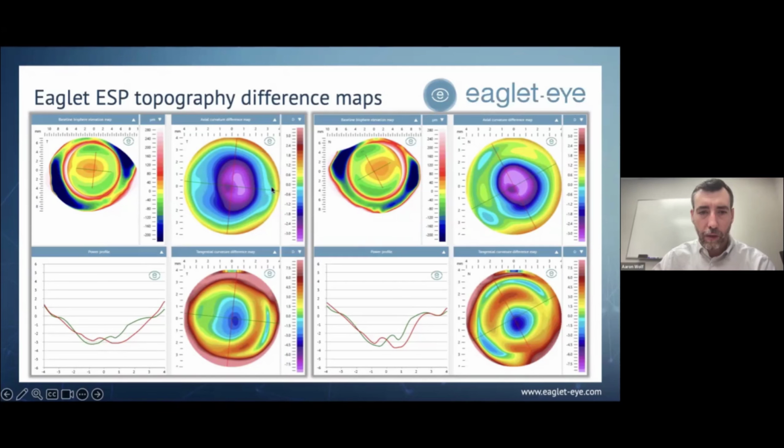Where's my green start? Well, my green's a little bit further out over here. Okay, maybe it's a good 3 to 3.5 millimeters. And then on the other side, it's probably about 3.5 millimeters. So that's probably about a 7 millimeter range as far as where my change is happening.